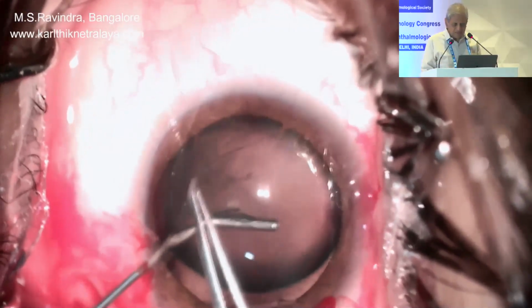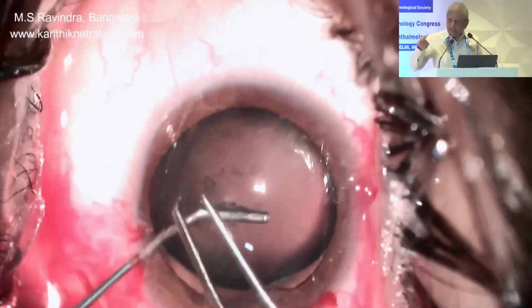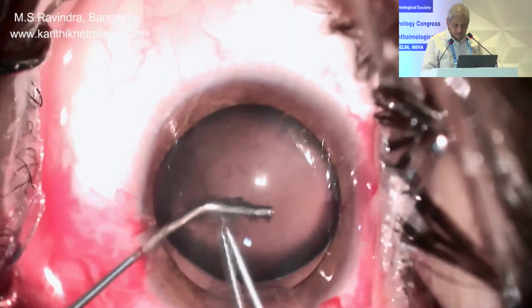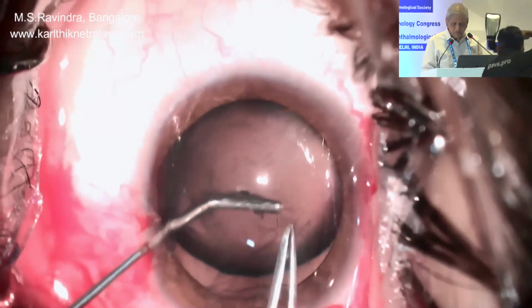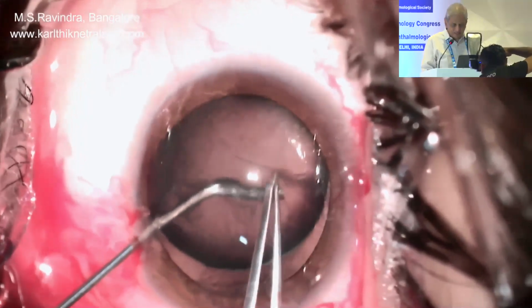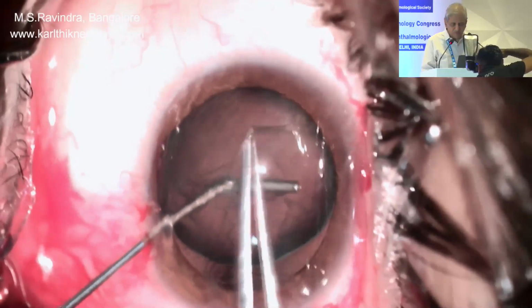Now with the rexis forceps I can hold the anterior capsule, like a handle holding the bag. I call it the bag handle technique. I'm doing a rexis and I could support the entire lens in spite of the very lax zonules, and I could complete the rexis.